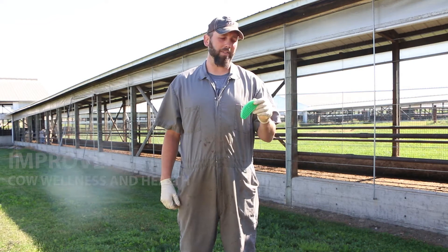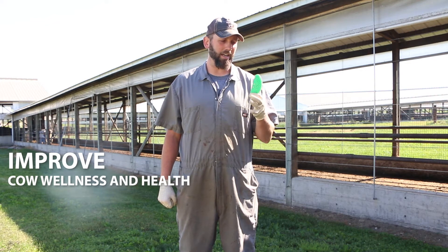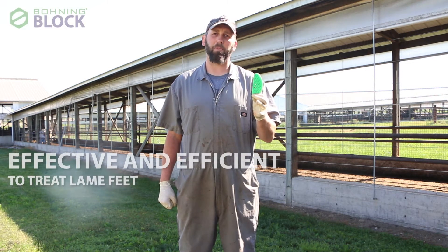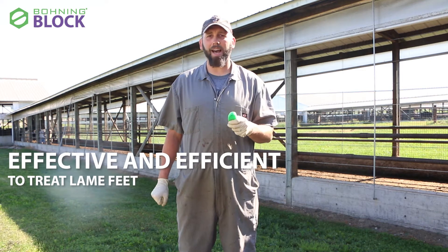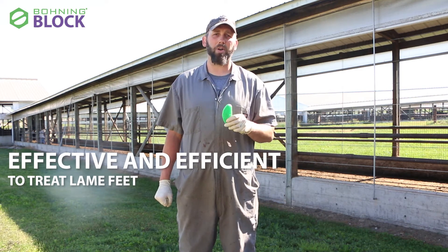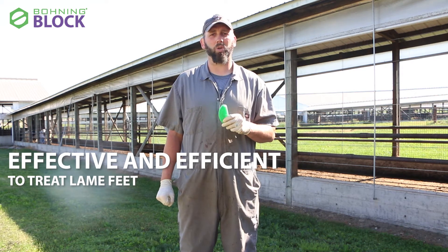One of the areas we're looking to improve cow wellness and health is an effective and efficient hoof block to help treat lame feet. My cousin Bob Potter, who's an engineer for a company called Bohning, said, 'Hey, we can come up with a cool tool that will help you guys out.'